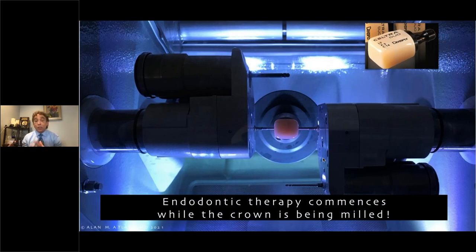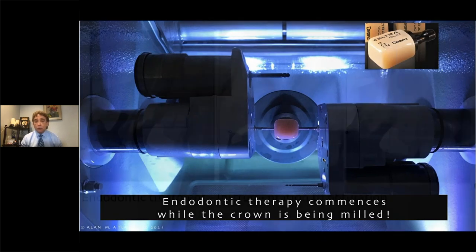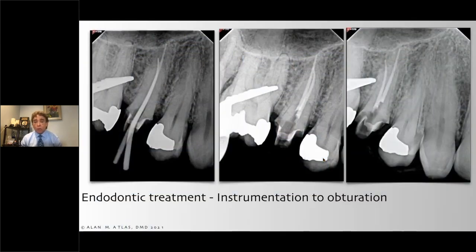If I have the ability to do this, this is a great procedure. I can do it all in one day, in one three-hour day. And this could be the most profitable procedure that you can do. And again, it has to be done under the microscope for better precision, the prep, the endo.